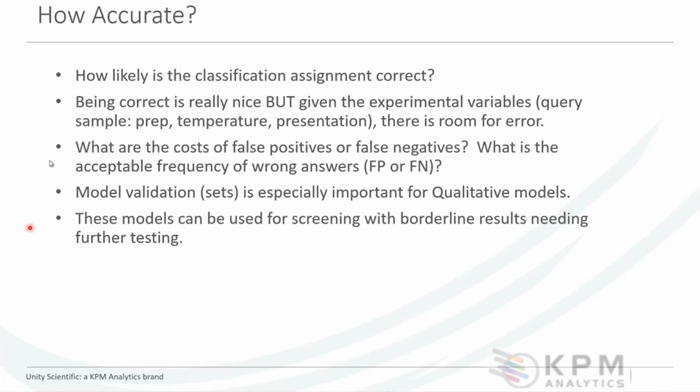So understanding that these classifications are based on limits, these limits are in gray areas. How you react to a fail is very important. But at a minimum, one of the things it can do is put that hand up and say, hey, we've got a potential issue with this sample. We need to investigate this further.